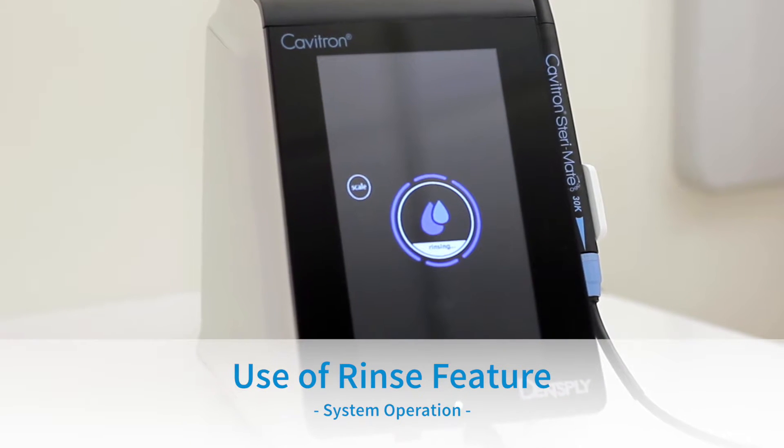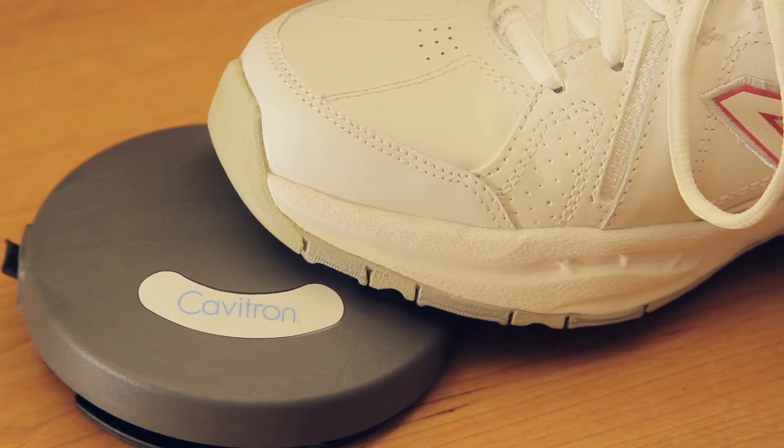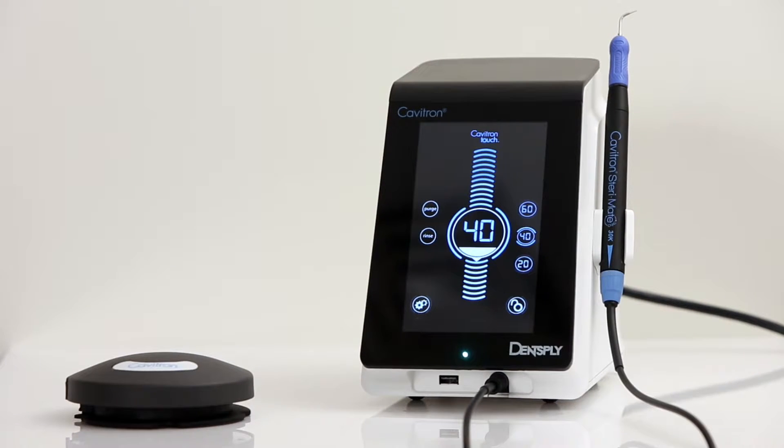Use of Rinse Feature: Users will operate this feature during an ultrasonic scaling procedure when lavage is desired with no cavitation. To use, press and hold the foot pedal for rinse mode cycle. To exit rinse mode, press the scale button to return to the main screen.